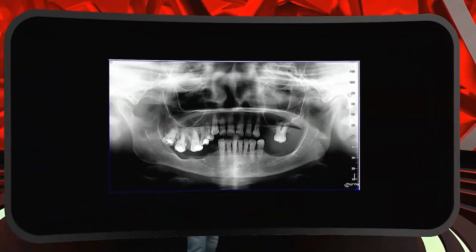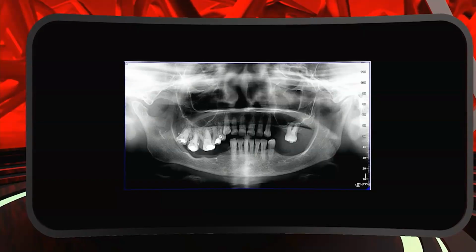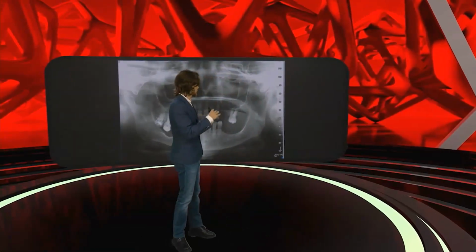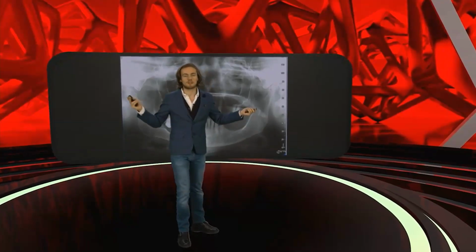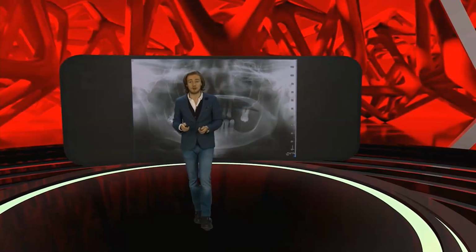This is also adaptation. You see that this patient doesn't even need posterior teeth because he already adapted. His occlusion is already adapted. He's chewing on the bone. How do you like it? I look at the condyles. The condyles are flat. So for me, it looks like rheumatoid arthritis. But you know, this is for sure combined with the lack of support at the back. So probably we have a couple of issues in here that created that image of the condyle.